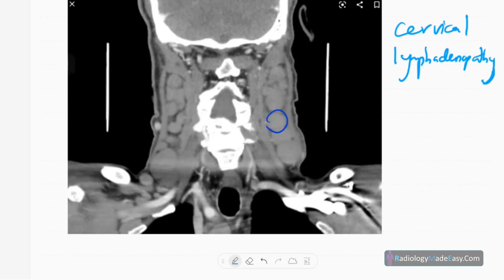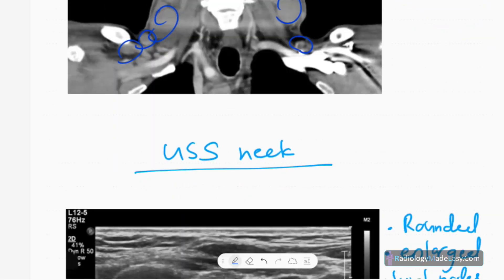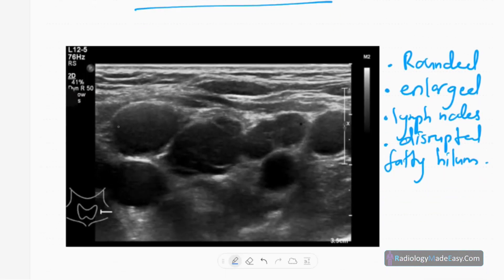On coronal CT of the neck, you can see multiple cervical lymphoma nodes — rounded, enlarged lymph nodes at almost all levels including supraclavicular, level 3, and level 4. On ultrasound of the neck, you can see multiple rounded matted nodes with loss of the fatty hilum, enlarged and rounded, with no necrosis and no calcified foci. This is cervical lymphadenopathy.